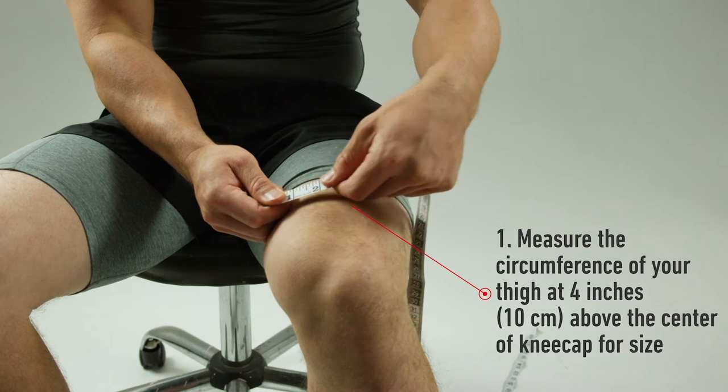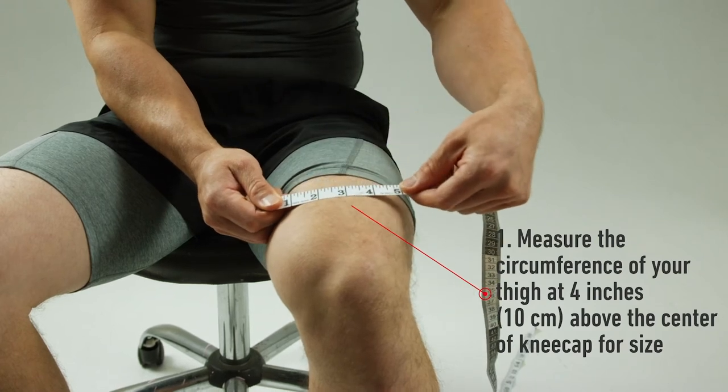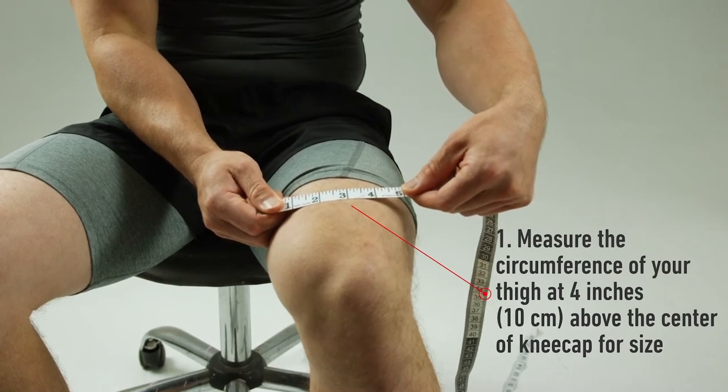To select your size, measure the circumference of the thigh at 4 inches or 10 centimeters above the center of your kneecap.